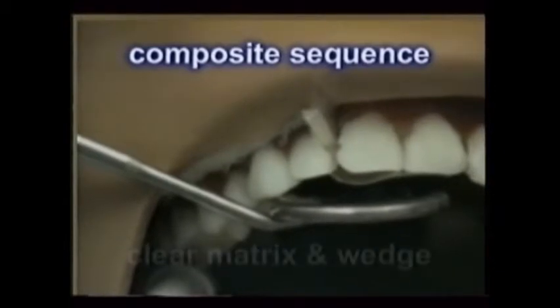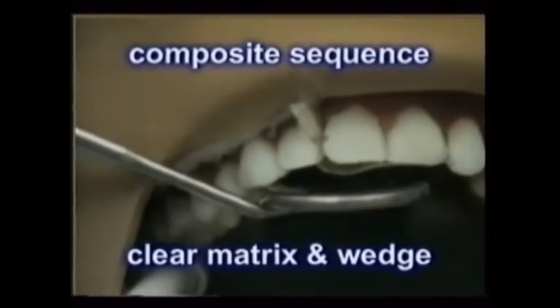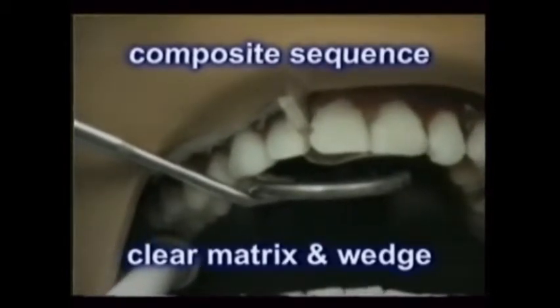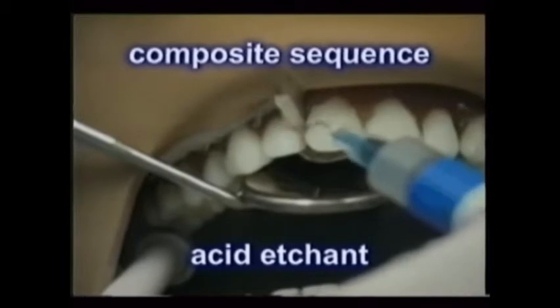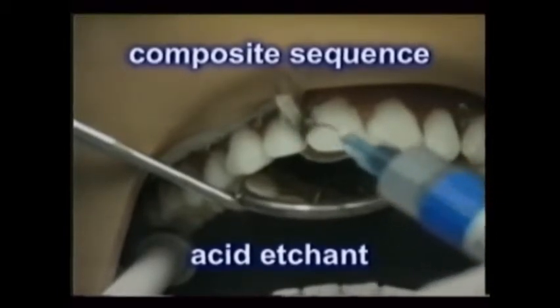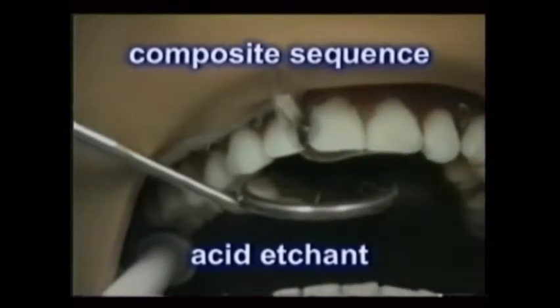If the filling is being placed between the teeth, a clear matrix band that the bright curing light can shine through is placed, with a wedge holding it. The colored acid etchant cleans and roughens the enamel. It's placed using a cotton pellet and cotton pliers, or with a special small brush. Be sure to apply it for the time recommended by its manufacturer.